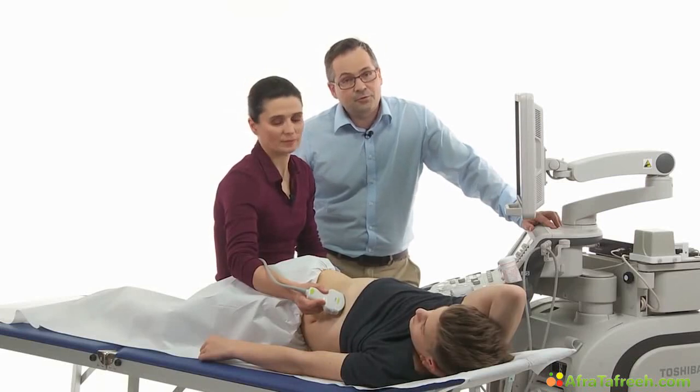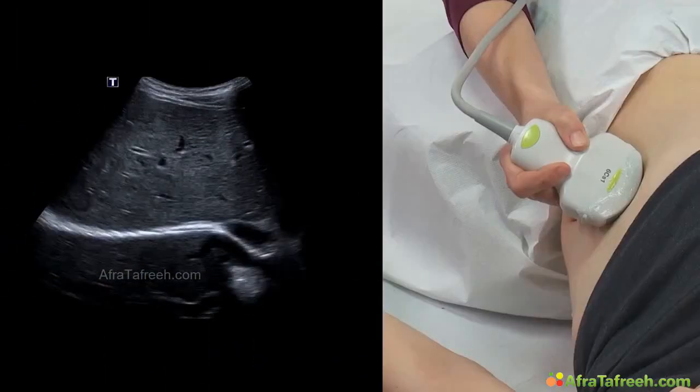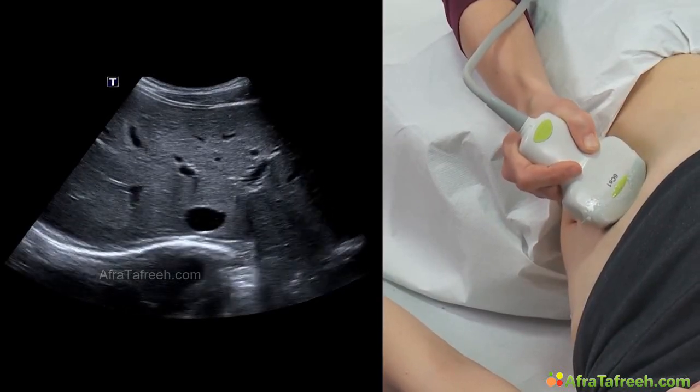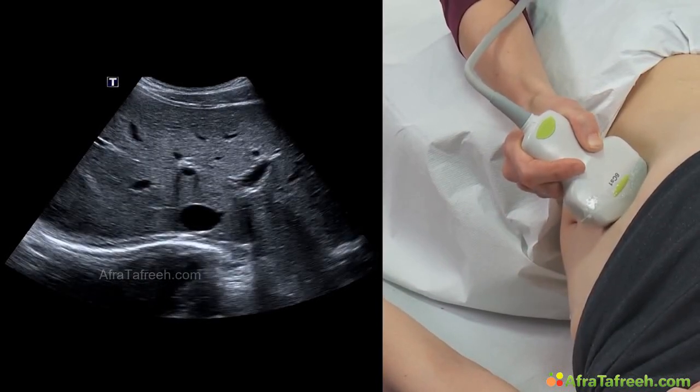After we have seen the confluence of the liver veins, we proceed with the transverse scan, and I think we are going to see the next animal. Yes, please take a deep breath. I just continue my sweep downwards from the confluence of the liver veins, slowly. I proceed until I see this structure over here. You press the freeze button.